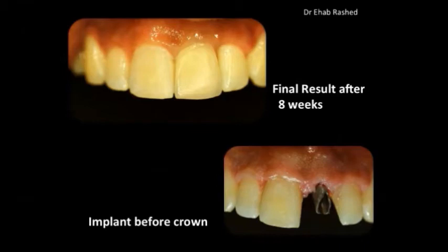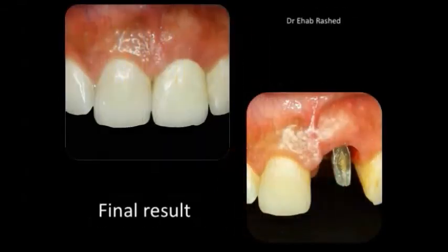The gingiva did not recede. We have good papilla. We have all the thickness of the buccal bone and the soft tissue looking very healthy. This is another case with the same parameters as well.